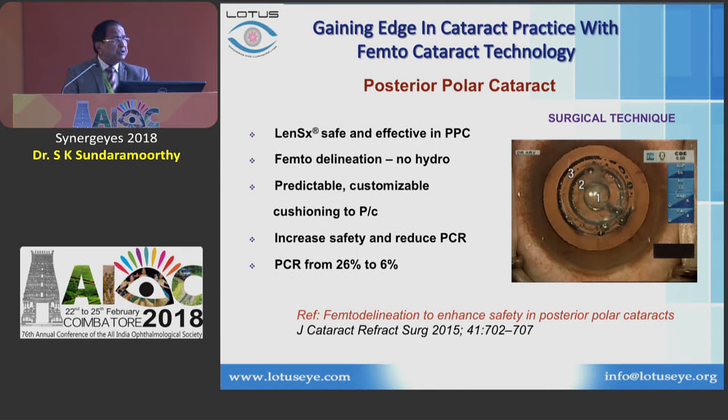There is a posterior polar cataract study done by Dr. Vasavada and team. This is a surgical technique, femto delineation without hydrodissection. He has demonstrated that this particular technology has reduced the PCR from 26 to 6%.